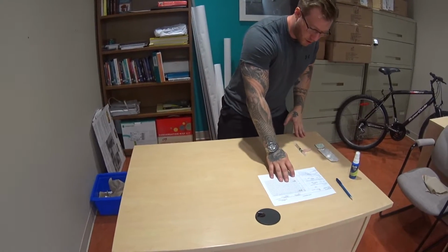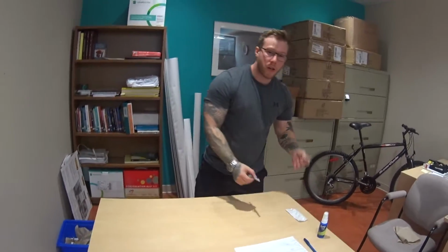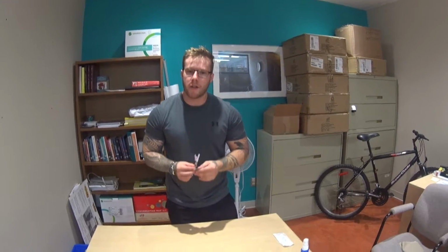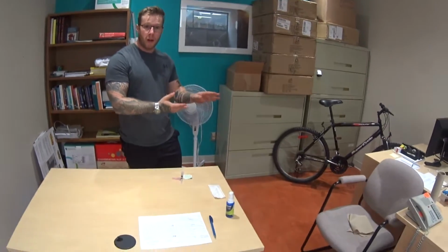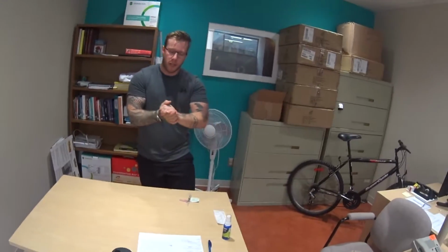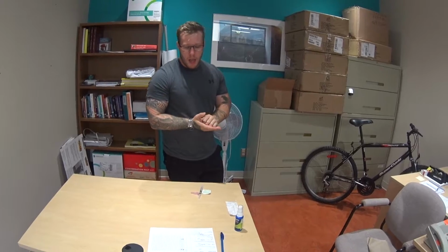Awesome. So I'm going to gather my supplies and go see Joe Milton in his room. I'm going to grab my syringe, some more alcohol swabs, possibly a Band-Aid as well, and a cotton swab. I'll head over to Mr. Milton's room. Before I go in, I'm going to use hand sanitizer again, making sure my hands are nice and clean. And at this point I'm going to put some gloves on.